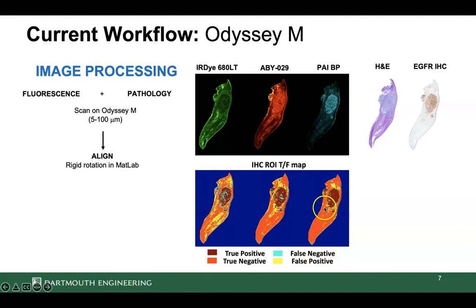And it's not surprising, but a lot of the uncertainty comes in the margins. And this is where we will move forward with computer learning or large data set comparison in order to really determine if we can improve the diagnostic accuracy.